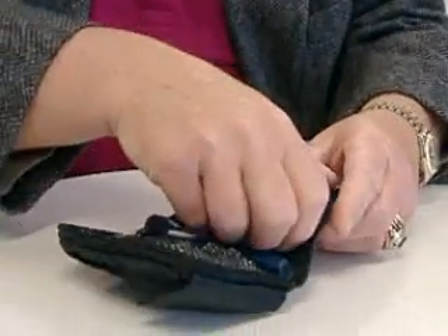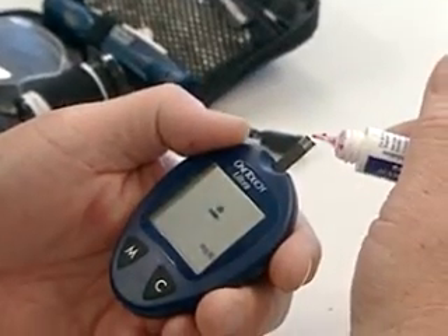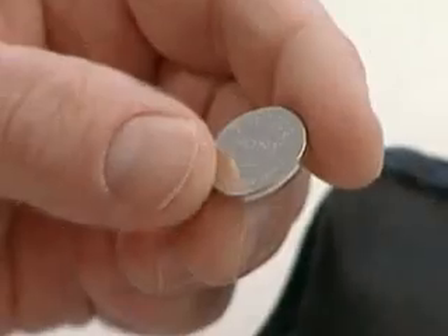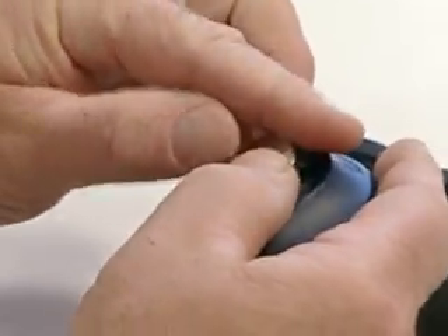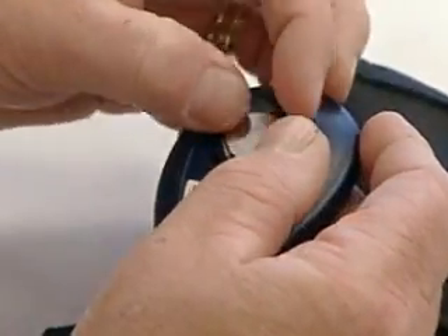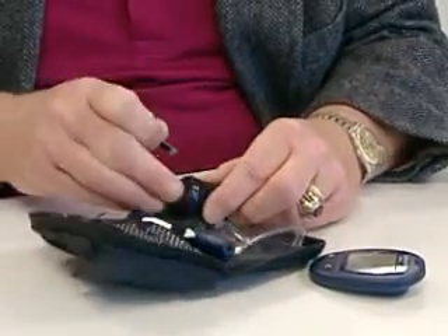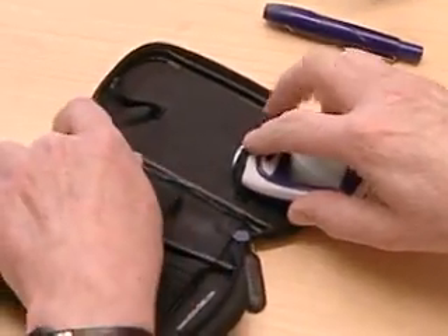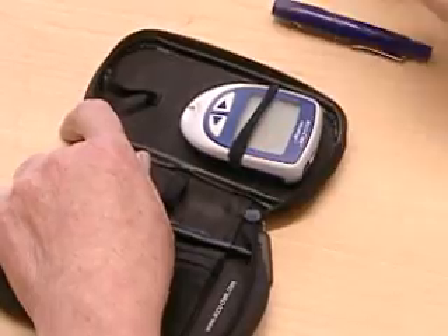Storage and maintenance are important too. Be sure to keep your meter clean and test it regularly with control solution. Have extra batteries charged and ready. Heat and humidity can damage test strips, so replace the bottle cap promptly after removing a strip. Store your meter and supplies according to the manufacturer instructions.